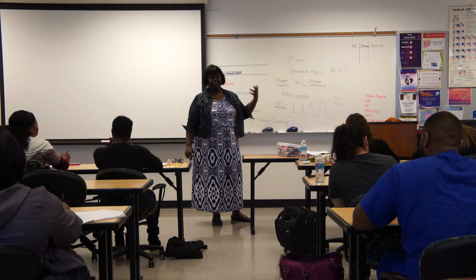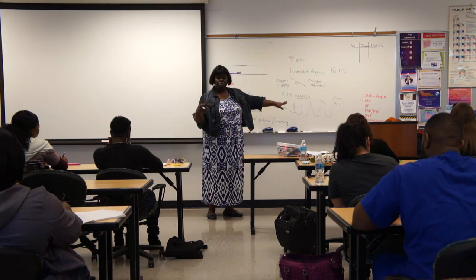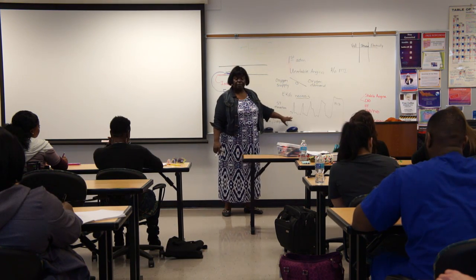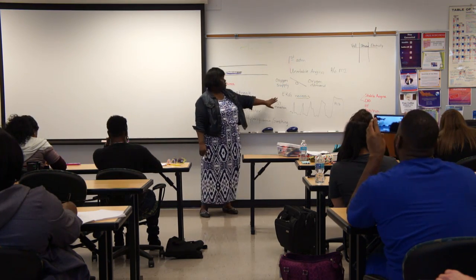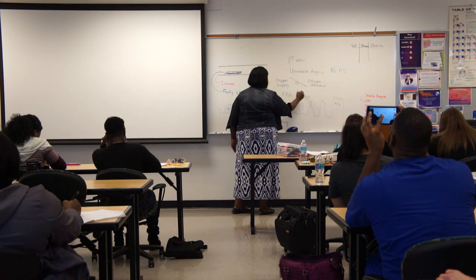Now what's neat about this whole thing is you can see that on a patient. You know tissue is dying. If you give thrombolytics, you're going to see that go back to this. That's exactly what happens to it. That's what you want to see happening with a patient. But this one is going to be with acute MI. So you put that up there. This is a patient who has an acute MI.